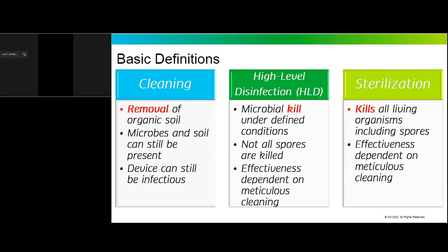If we move to the middle bucket, disinfection, that's a process used to destroy microorganisms using cleaning disinfectants, using chemicals. Disinfection is less lethal than sterilization and typically does not kill all bacterial spores. So even the high-level disinfection process, by definition, is not required to kill all bacterial spores. So while disinfection is appropriate for items that touch intact skin or disinfecting surfaces and equipment in your clinic, it's not effective for critical items.